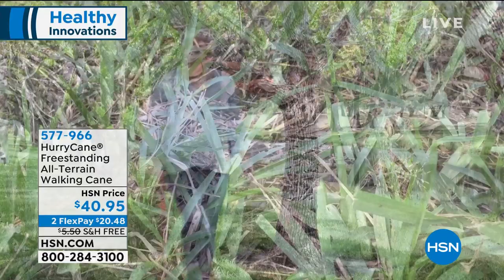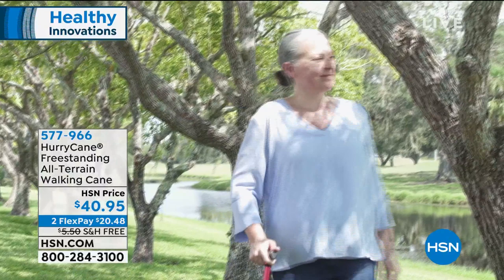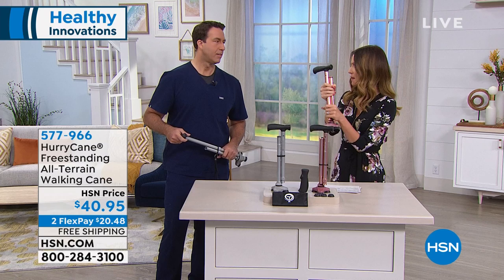This is why the Hurricane is so popular. It's all terrain — very, very sturdy and steady — but it folds into just about nothing. This is such a brilliant design; it's like a physics marvel to me. It really is.